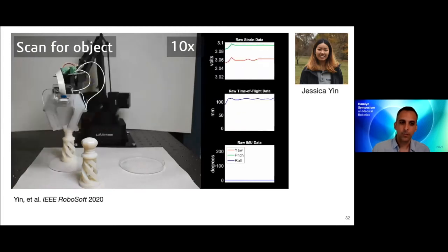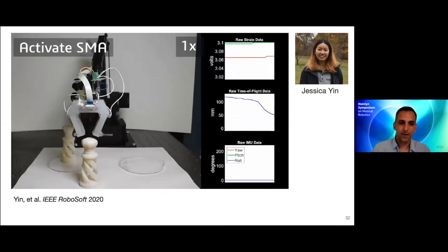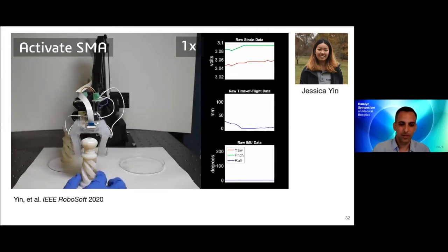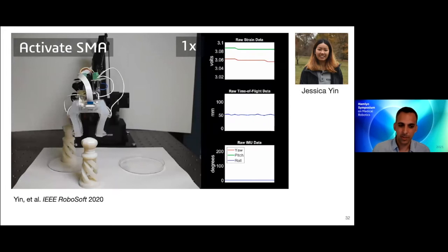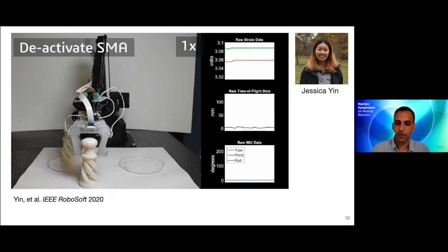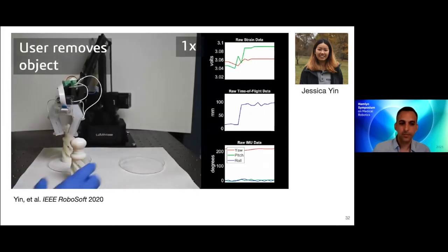And so the robot knows to go and reattempt the localization. And again, when it goes to pick, we're going to disturb the operation by preventing the gripper from lifting up the object. This is something that's going to be detected by the onboard pressure sensor, right? So the robot knows that it did not successfully lift up the object, so it should attempt it again. Anyways, hopefully that gives you a flavor of how these types of onboard sensing skins can enable autonomy of these robotic systems.